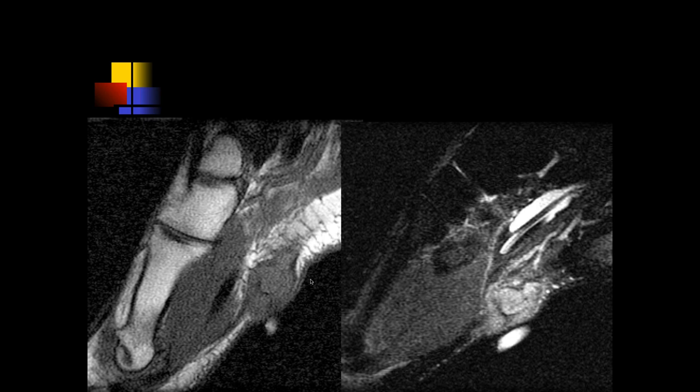Here we can see intermediate T1 and slightly increased STIR signal intensity along the plantar fascia — this is another large plantar fibroma. Sometimes when they get large, people call them fibromatosis — plantar fibromatosis, that's the old term. I really think a lot of these are hyper-exuberant healing due to plantar fascia partial tears, but they keep growing, so that theory is probably only partially true and certainly not in all cases.